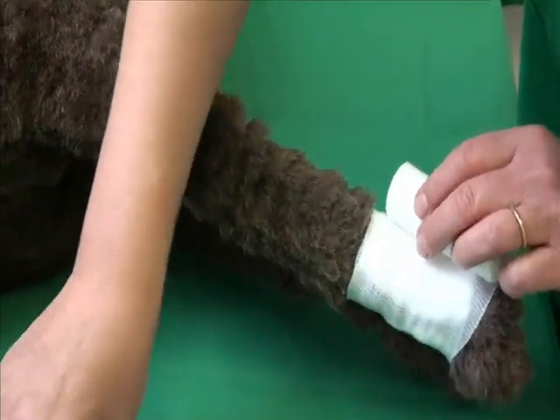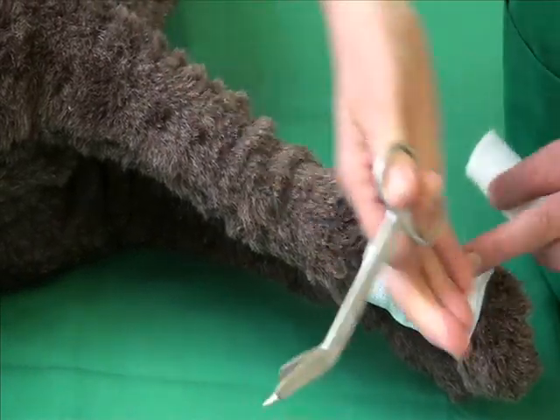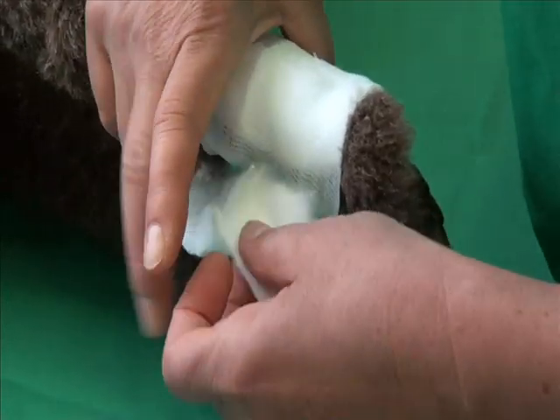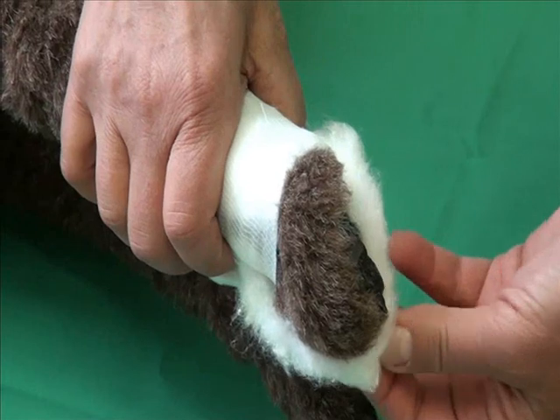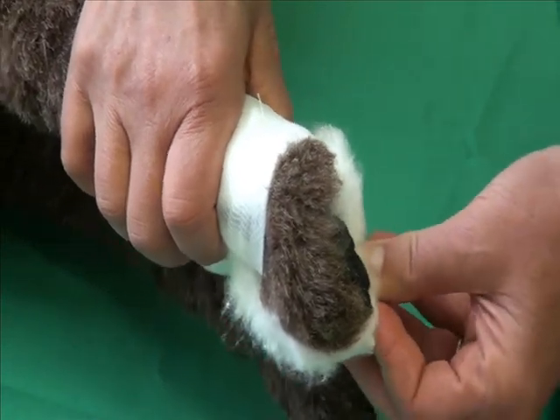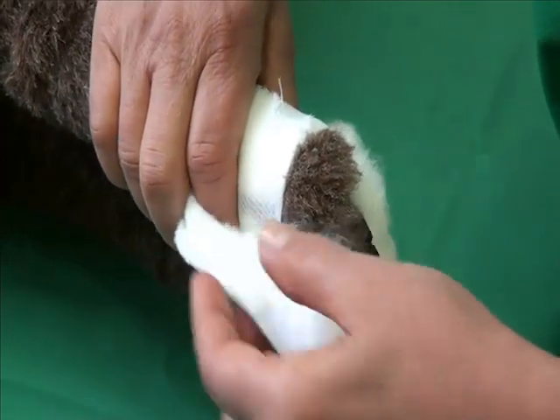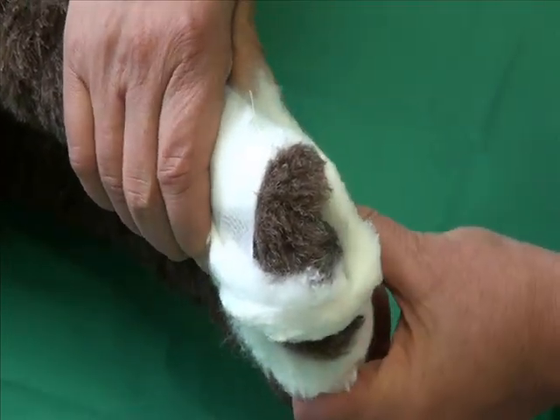The dressing is now fixed loosely with a gauze bandage. Next, the secondary layer is applied, which consists of padding. The areas between the toes are padded with a cotton wool strip. It is easiest if one hand can hold all the strips. It is important to ensure that there is also padding surrounding the dewclaw, which was done earlier in this example.